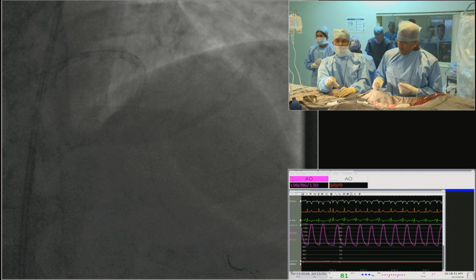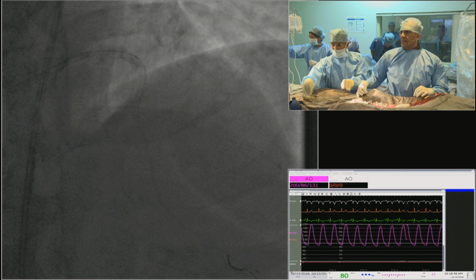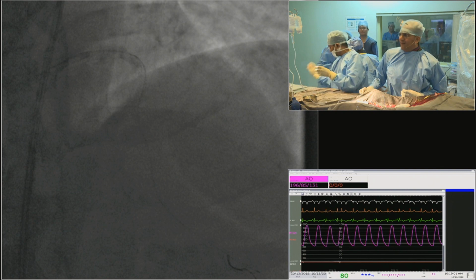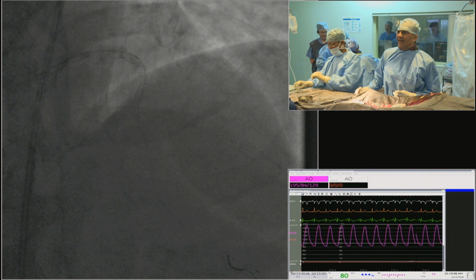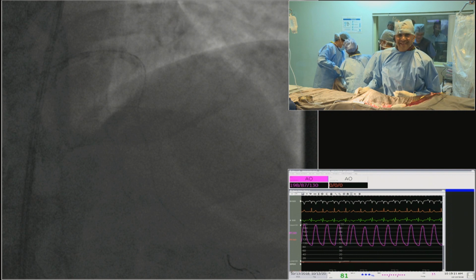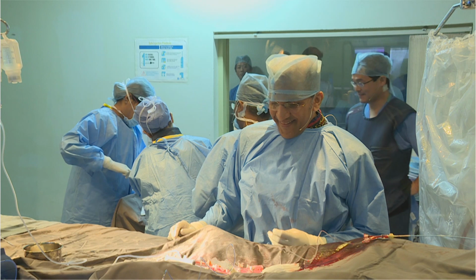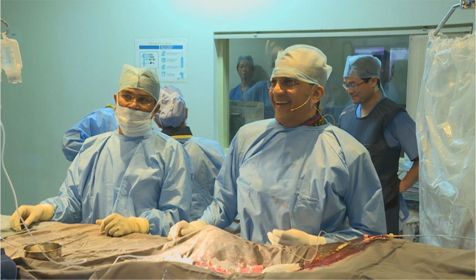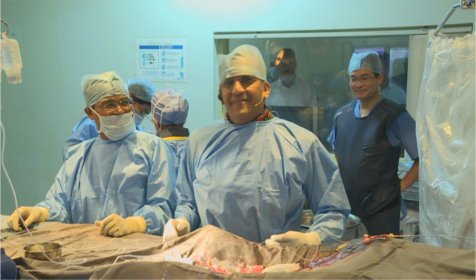Sure. What is your tip? If he wants to take the same balloon, if he's taking new, then I will. You can tell us. Is it a trade secret? You should give the tip for the other people, for the less privileged. We all know that, we all have our own tricks. Everybody, we've been inflating balloons and guides, remodeling, reshaping them, and getting them across. But let him do what he's comfortable doing. I'm very cross with the guy who doesn't want to give me the tip.